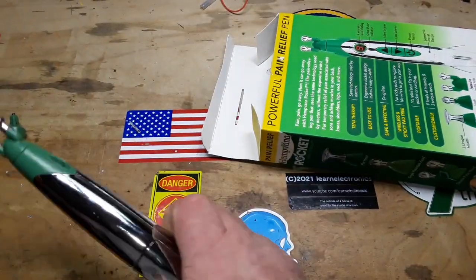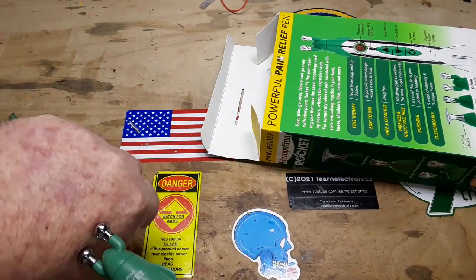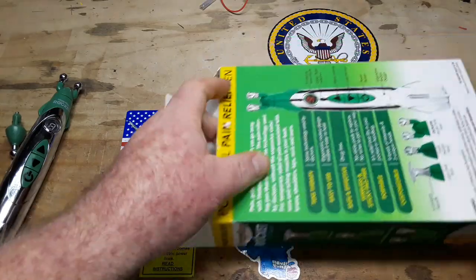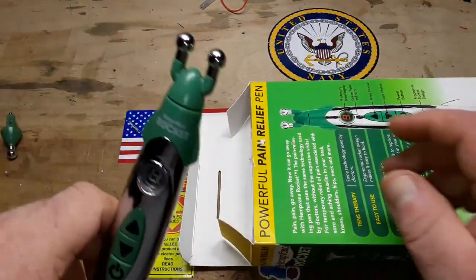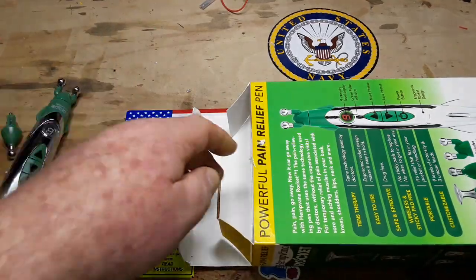It's a good concept, and if they would have stuck with it and done two contacts, that'd be great. But there's no metal in this — these are plastic, just coated with conductive paint.